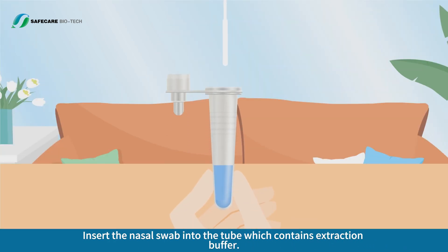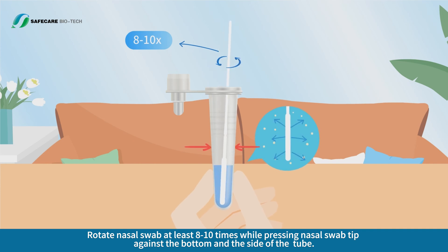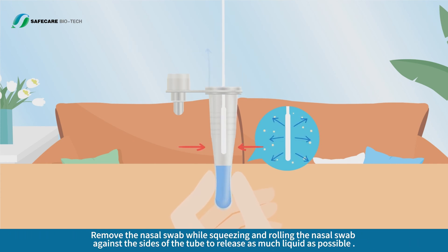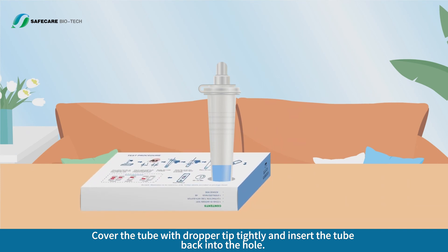Insert the nasal swab into the tube which contains extraction buffer. Rotate the nasal swab at least 8 to 10 times while pressing the swab tip against the bottom and the sides of the tube. Remove the nasal swab while squeezing and rolling it against the sides of the tube to release as much liquid as possible. Cover the tube with the dropper tip tightly and insert the tube back into the hole.